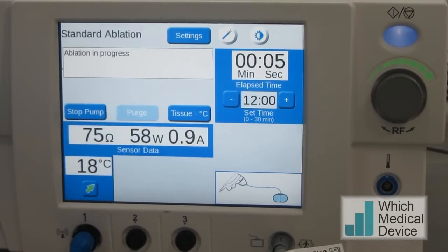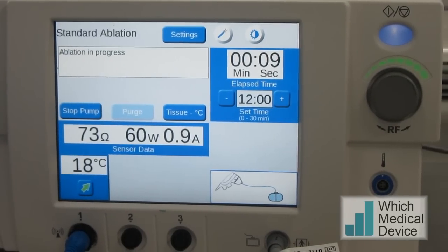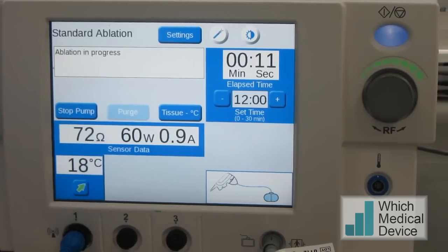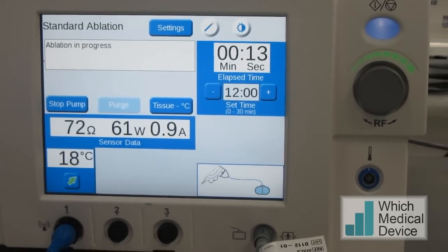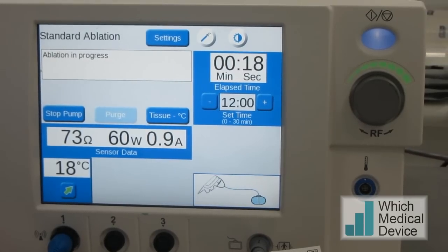The ablation's started now. You can see it's 58–59 watts at the moment, with an impedance of 73 ohms. As the impedance goes up, the power will drop off, and then it'll cycle and start ramping up the power again.